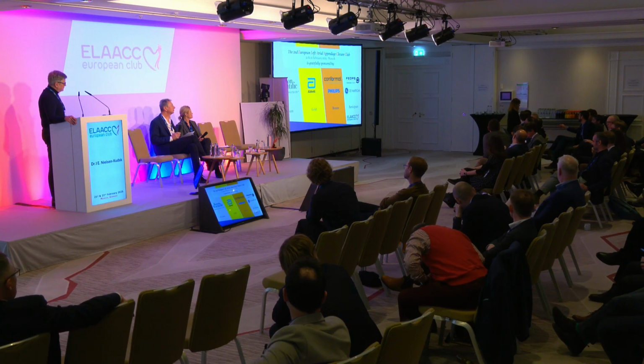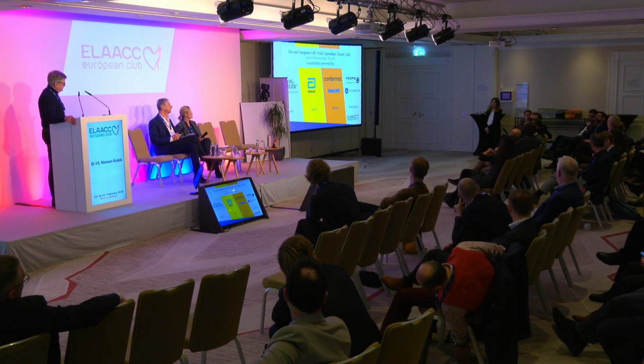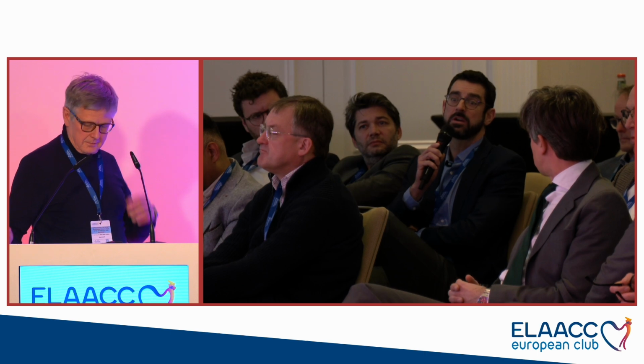Savi? I had more or less the same comments. Very few countries in Europe could afford to use this catheter as a single-use tool. But actually there is a trend in many European countries, towards the ecological transition, to authorize the re-sterilization of catheters like this. Although this catheter cannot be reused, this type of catheter, like EP catheters, probably is going to be authorized for multiple use after re-sterilization.